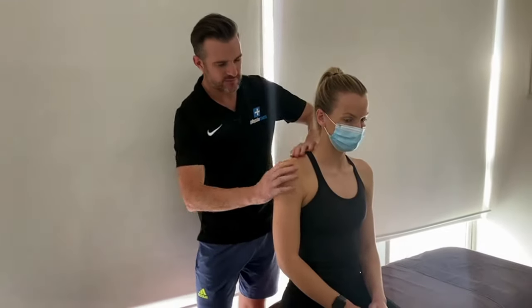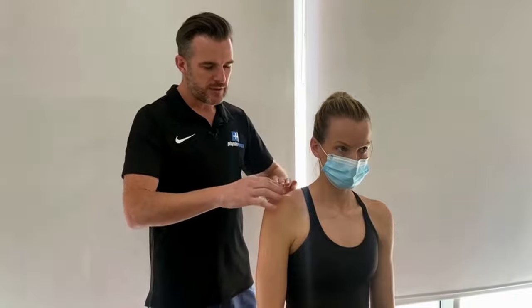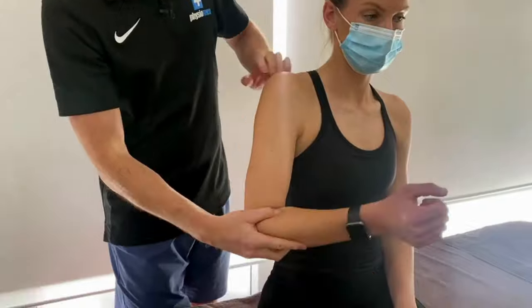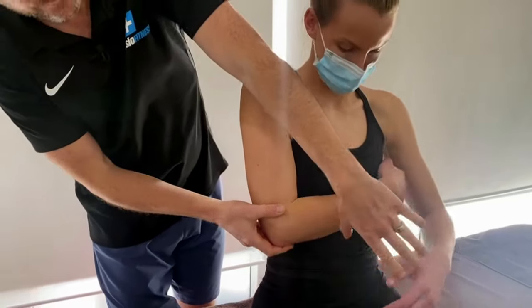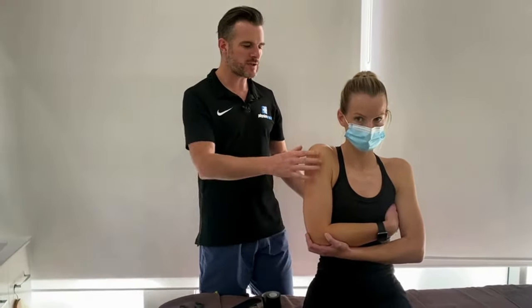They need to be in a position of elevation. Think about it — the AC joint is the only physical bony attachment of the whole shoulder to the spine; the rest is muscle suspension. So if I can unload that, I need to bring it upwards. I get them to cradle their arm with their other arm in the position that gives them relief, which is usually elevation.